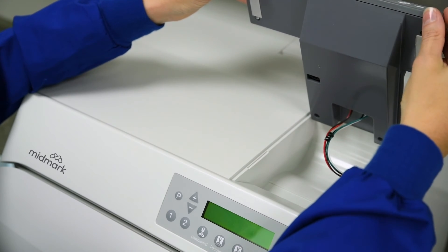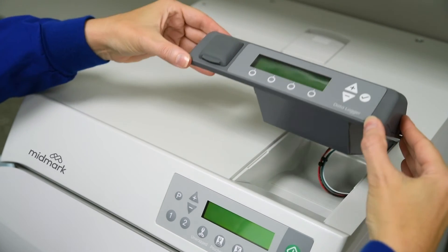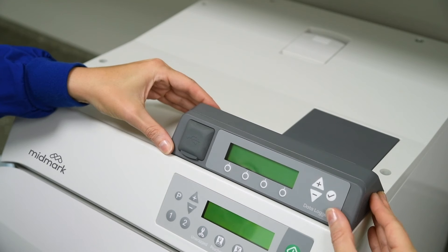Then rotate the front edge of the data logger down and into place. Press down firmly on the data logger to secure.